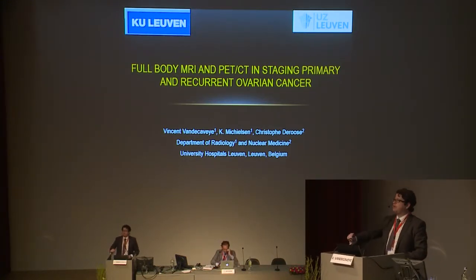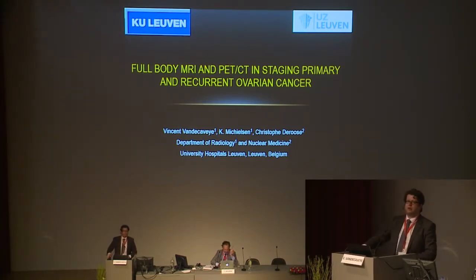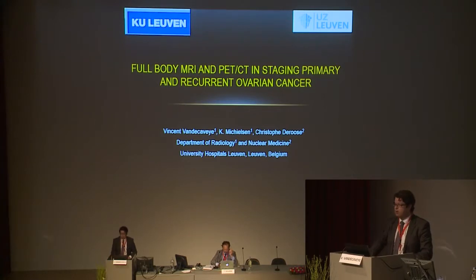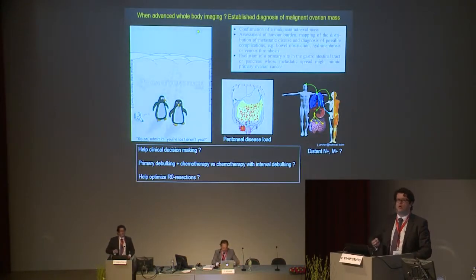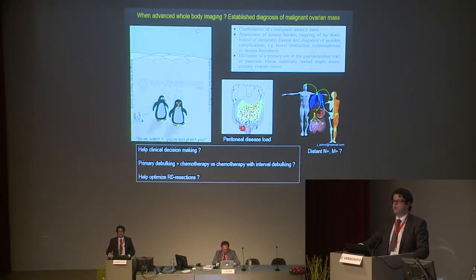Actually, the topic was quite challenging because if you have to discuss both whole body MRI and PET-CT, you easily have a presentation of 3 hours, which of course I will not do. So we take it to the core: what is the role of the radiologist, and when will you go to whole body imaging?